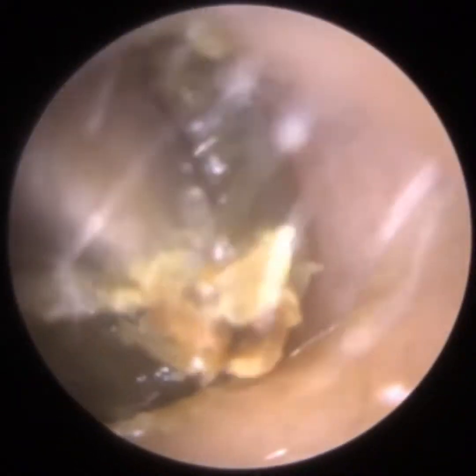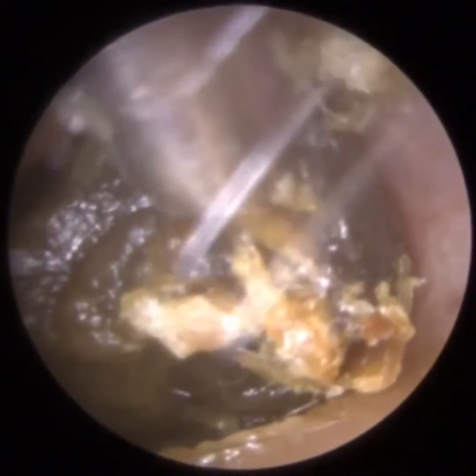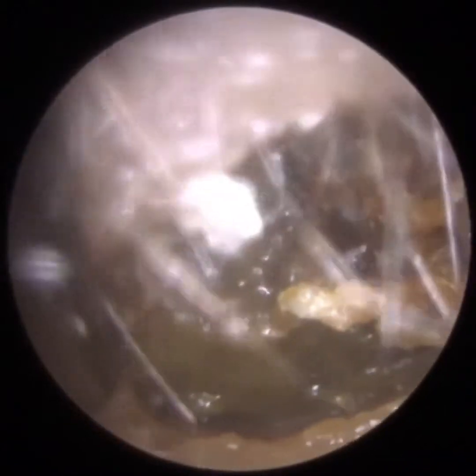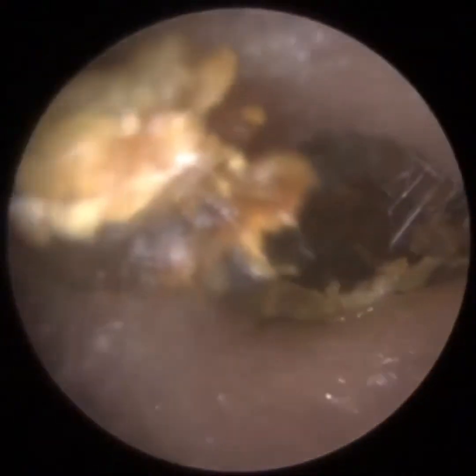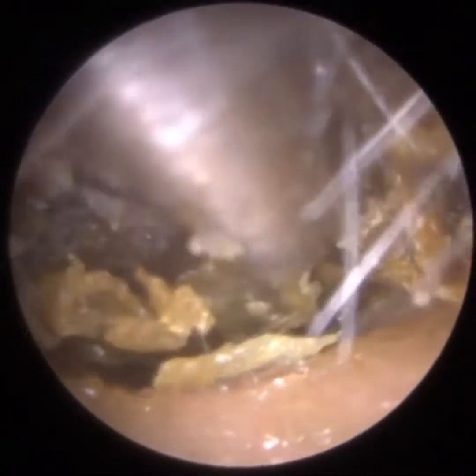Similarly to the patient's right ear, I was just talking to the patient, reassuring them, just so they remain still, because I know I've got a steady hand, so I'm not going to be causing any trauma to the patient. It's when the patients move themselves that you're going to have possible injury, because as I said, the ear canal is so narrow, it's not a large orifice, and so as long as the patient themselves can keep their head still, we'll be fine.